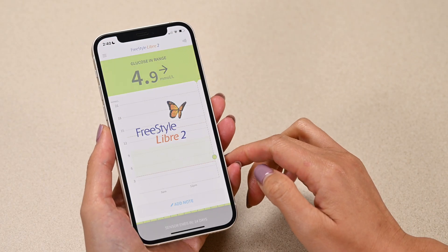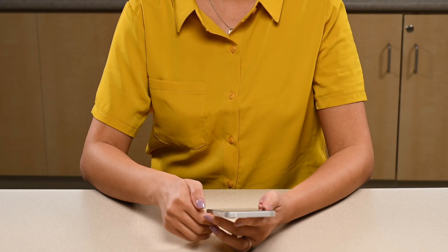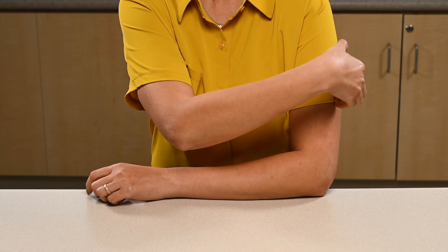Open the app any time you want to check your glucose readings. If there is no reading or the connection is lost, scan the sensor with your phone to reconnect the sensor to the app.